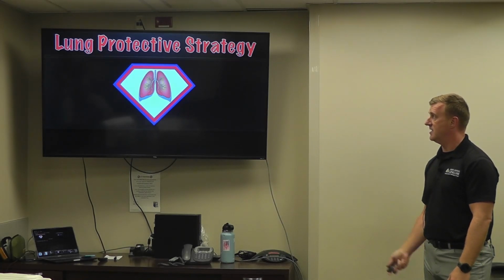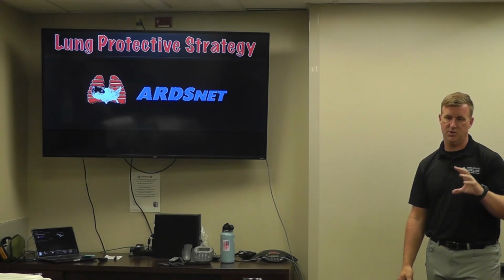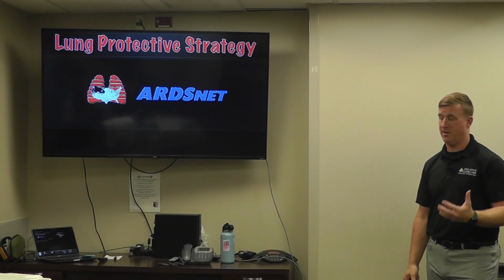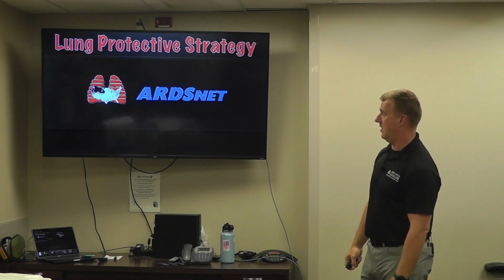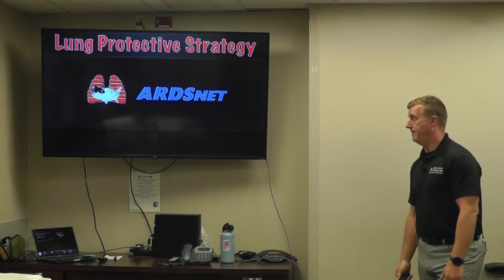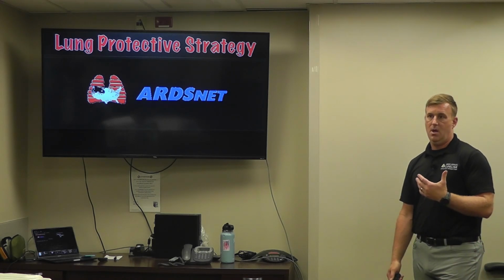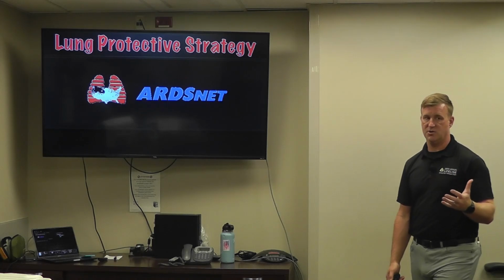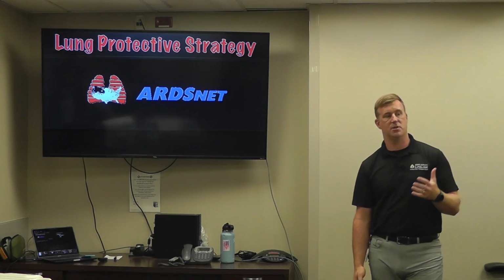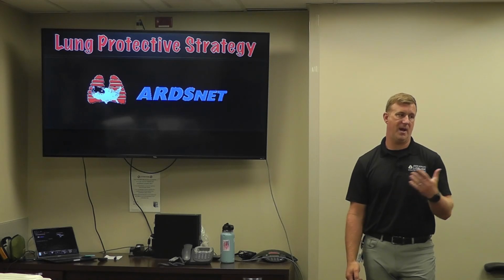So we're going to talk through the lung protective piece here. Much of the lung protective information and much of the stuff that we talk about with the lung protective strategy came out of some very old studies now. I hate to admit that I remember when these studies were done. But the ARDSNet studies basically figured out that we, before about 20 years ago, were causing iatrogenic lung damage. So we were actually overventilating people and causing people to go into ARDS by how we ventilated them.